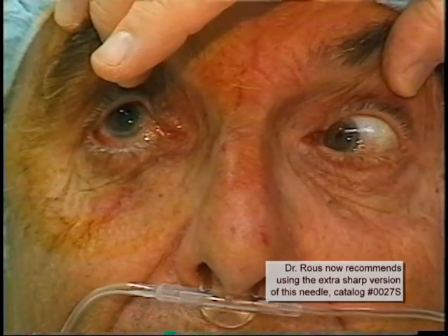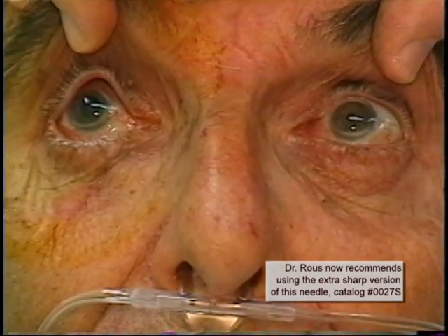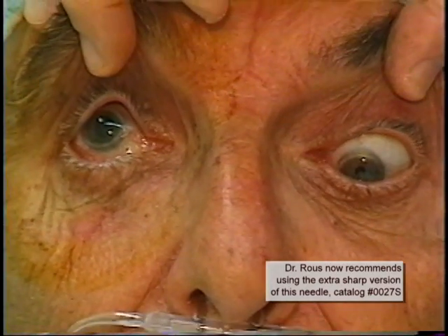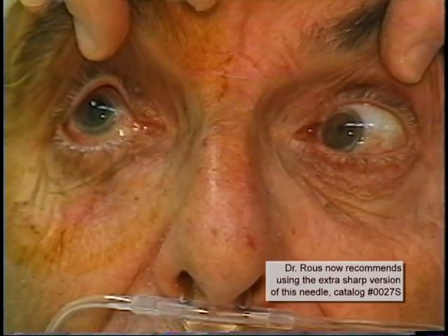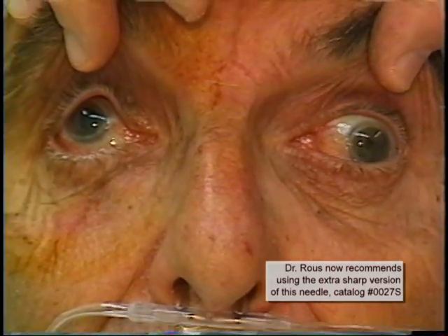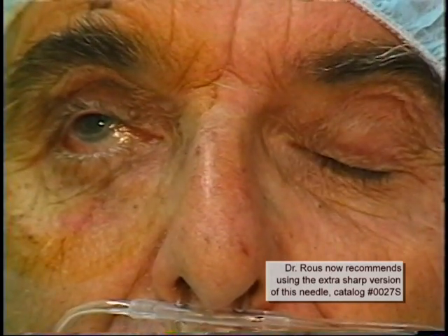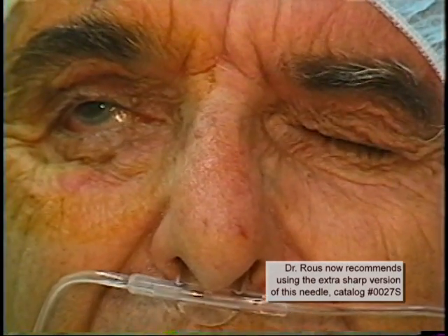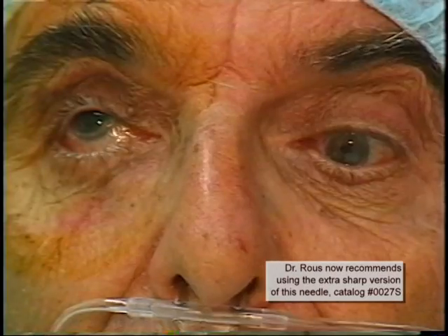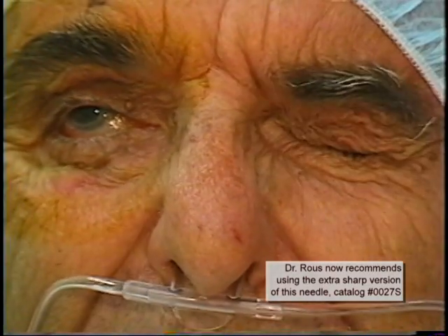As you can see, this patient has achieved an excellent block with good akinesia and no right eye movement right, left, up, or down. Also, there is only insignificant residual chemosis. And a nice lid block has occurred as well, entirely from the sub-Tenon's injection.